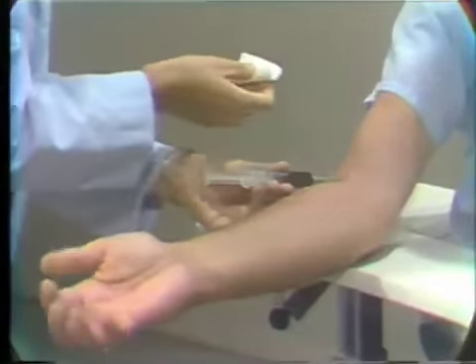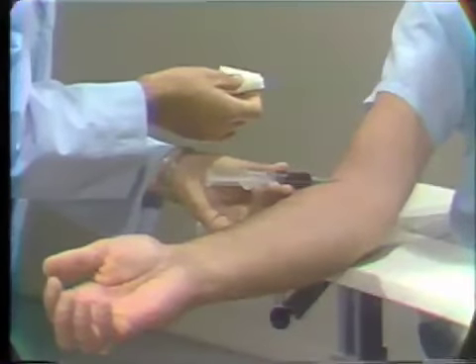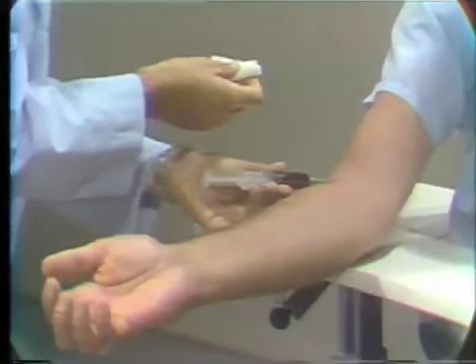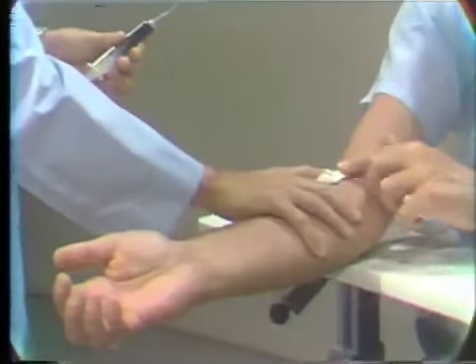Picking up my gauze, I will tell the patient to just relax. I will pull the needle out and press down hard. The patient will then press down on this for me. Then he will take and hold his arm up. Do not have them bend their arm, as this just drives the vessels in deeper and they stand a better chance of getting a hematoma.